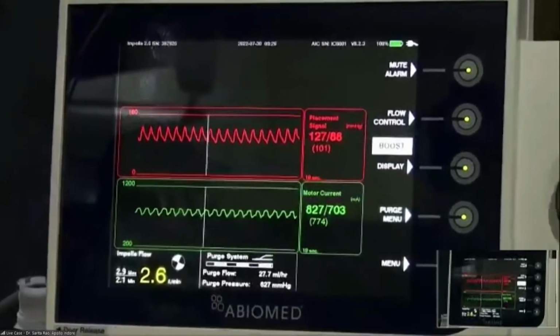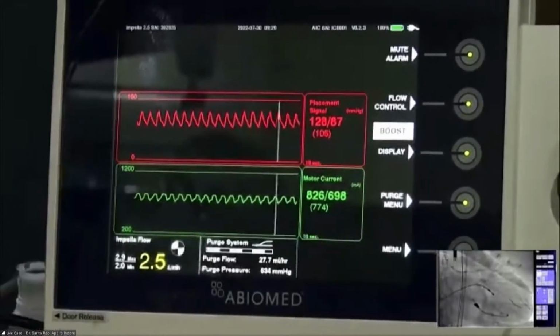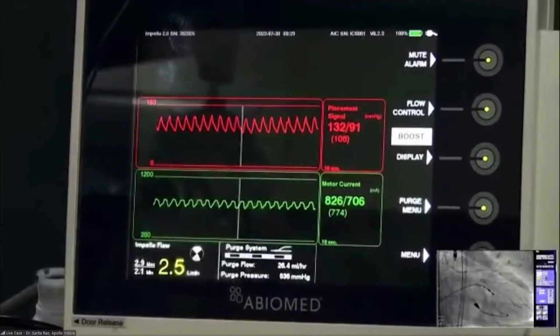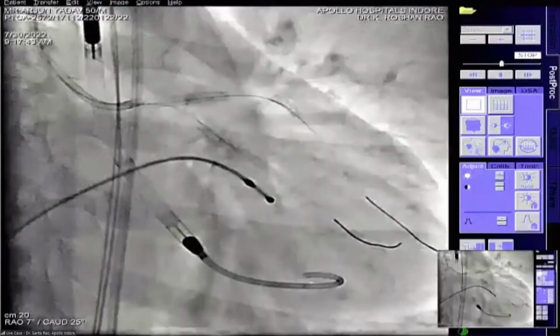Getting the stent balloon back and inflating in the ostium to flare it up is also important. You should do it right away before you get the balloon out, because once you get it out, there could be some challenges in going in again. So it's better to do all the steps straight before you get the balloon out. I think now the pressure is stabilized.